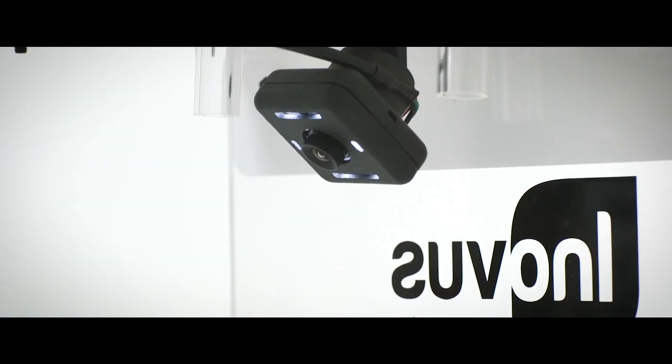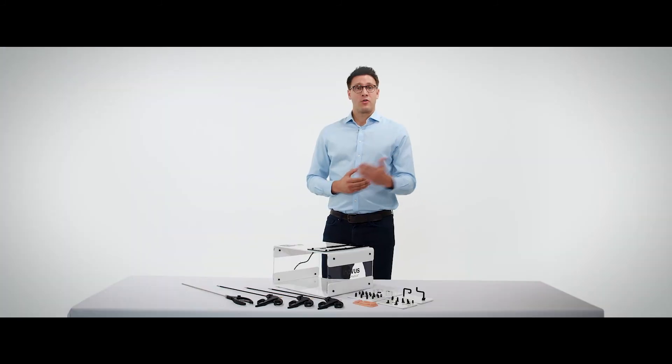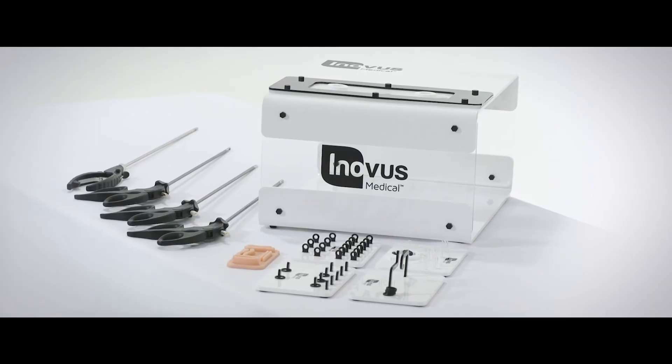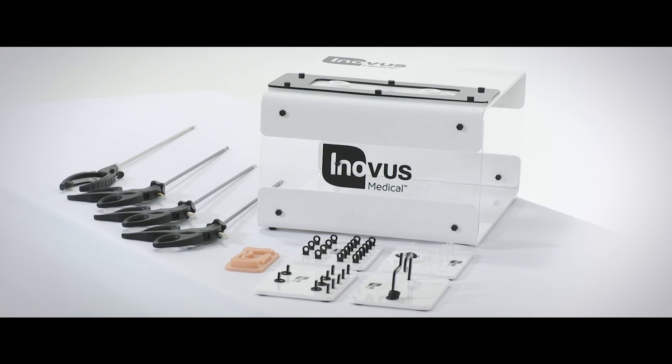Another unique aspect of the simulator is the fact that we have our direct light source built around our own HD webcam. This direct light source acts as it would do in the normal theatre environment, illuminating and creating the shadows that you'd expect to see in normal laparoscopic surgery, making this the most realistic laparoscopic box trainer experience you can find on the market today.